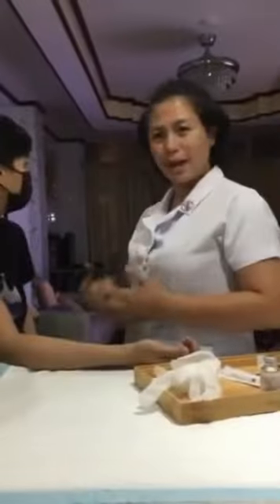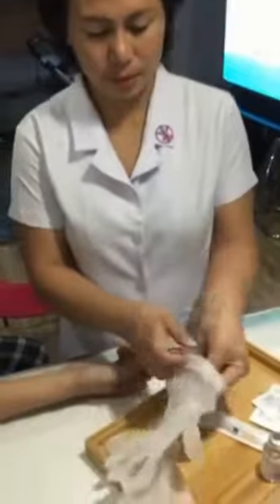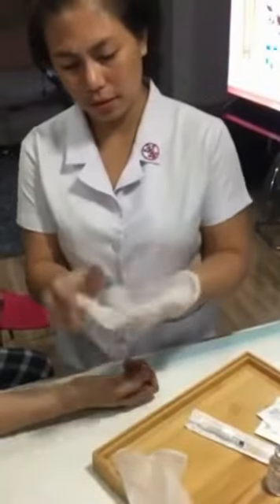It's time to select the site. It should be three to four finger widths below the antecubital space, and it should be somewhere here. Check for inflammation and any tenderness; report it if tenderness or pain is noticed. Now I will begin. Put on my gloves.